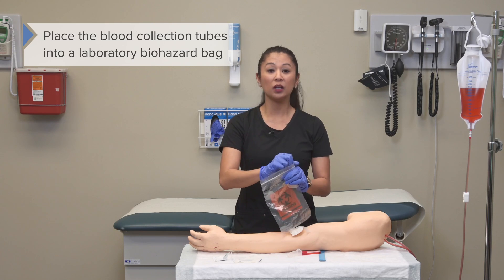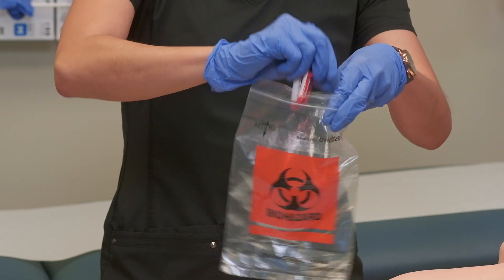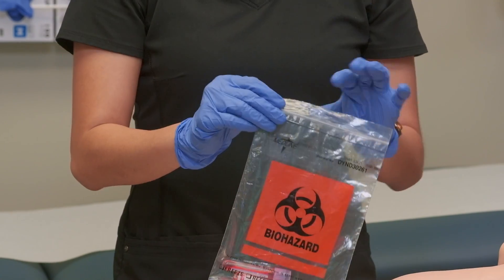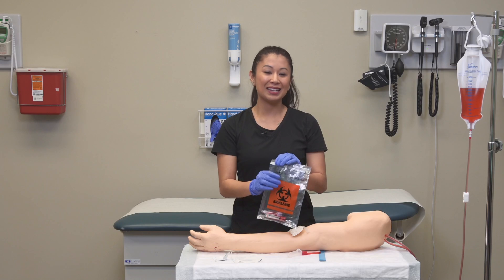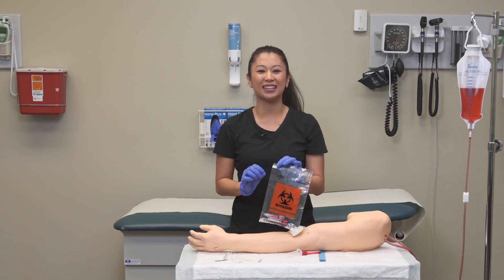Once labeled, place your blood collection tubes into the laboratory bag. All specimens containing blood or body fluids need to go into this type of biohazard bag.